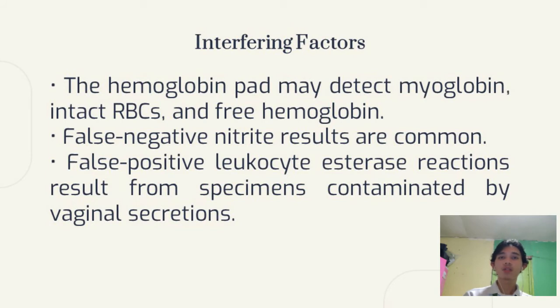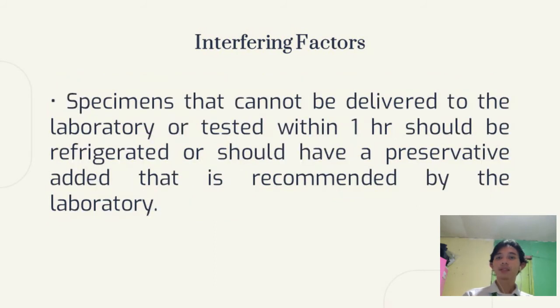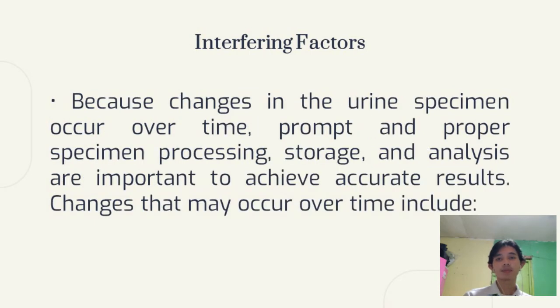Patients with neutropenia may also have false negative results because they do not produce enough WBCs to exceed the sensitivity of the biochemical reaction. Specimens that cannot be delivered to the laboratory or tested within 1 hour should be refrigerated or should have a preservative added that is recommended by the laboratory. Specimens collected more than 2 hours before submission may be rejected for analysis.